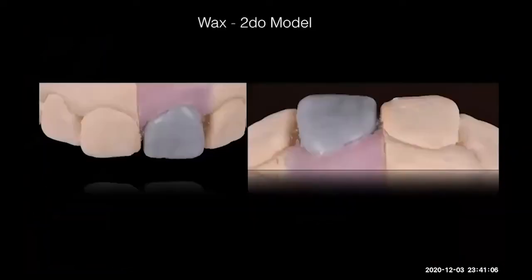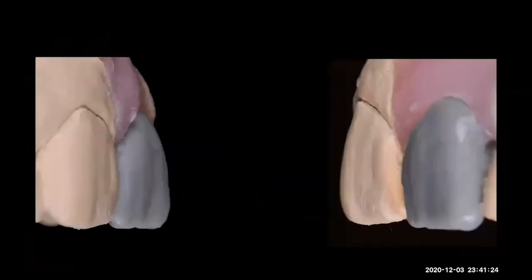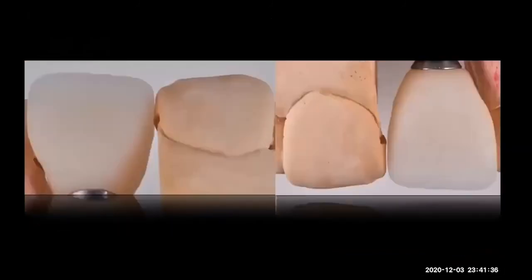You can see the GeoWax here in our model. I normally do 2 models. One is for delivering the crown, and the second is for our dirty job, because we do dirty work in the lab. We do shaping, we do scraping, whatever we need to do. Okay, then we press. We can do our nice anatomy, our nice contours, following the tooth that we need to copy. Now we have the press, we have the fitting.